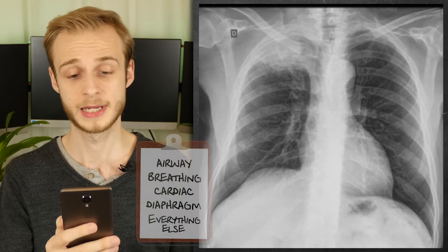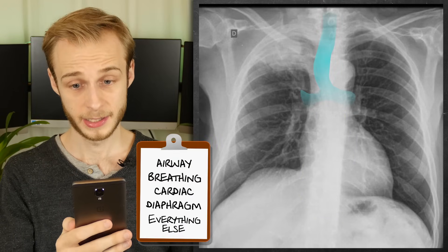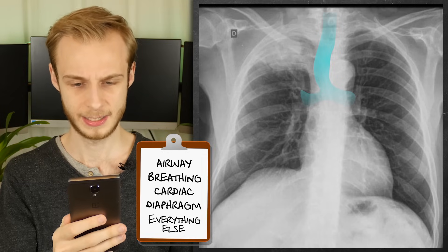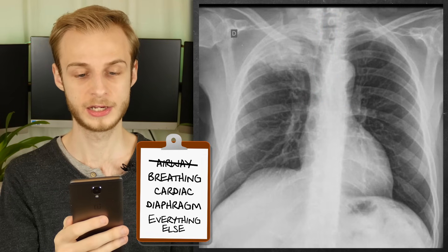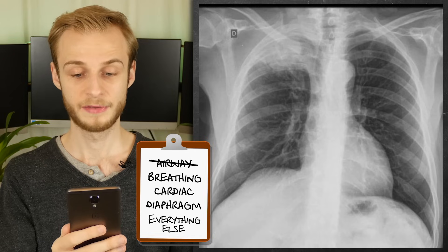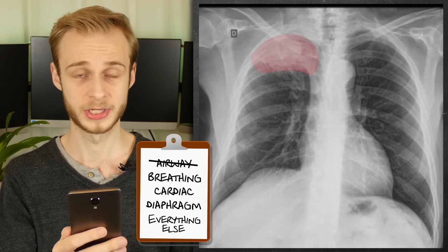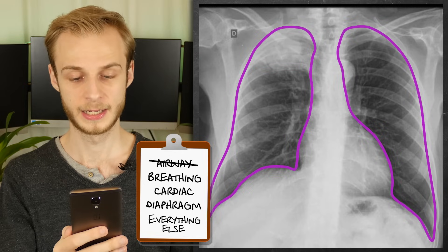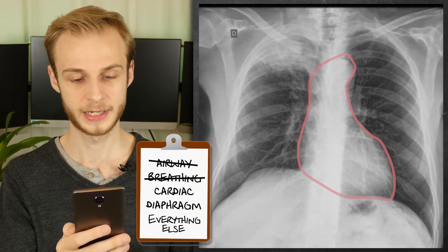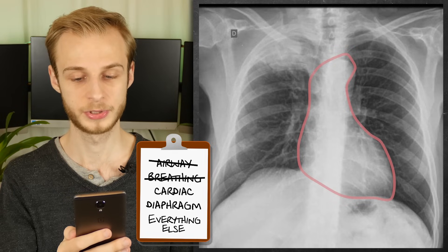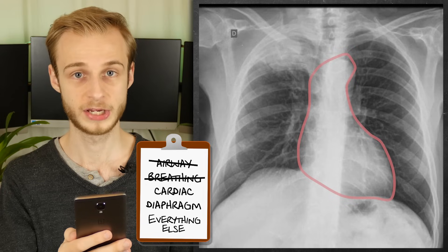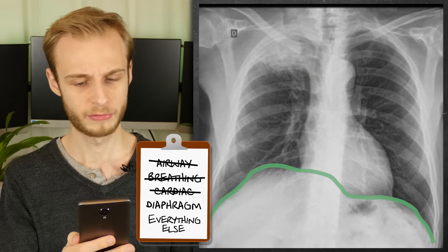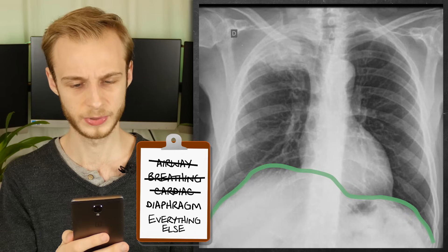Now on to our clinical assessment. The trachea is deviated towards the right side. The bronchi are obscured and a bit difficult to visualize. The left lung looks normal — no obvious consolidation or opacities. There is, however, a large well-defined opacity in the apical zone of the right lung. The pleura look normal with no evidence of thickening. The cardiac shadow is well-defined and of a normal size; I can visualize the arch of the aorta very easily, and the left ventricle and right atrium are visible. There does appear to be a small bulge in the diaphragm on the right side, but this doesn't look necessarily pathological.